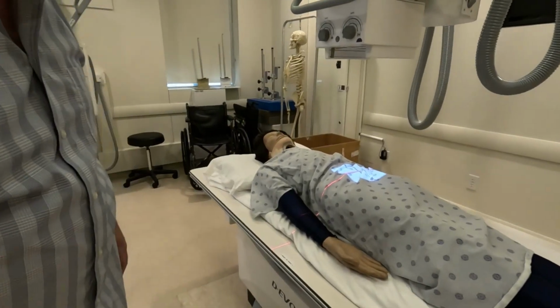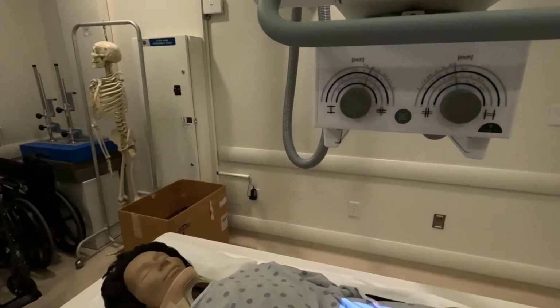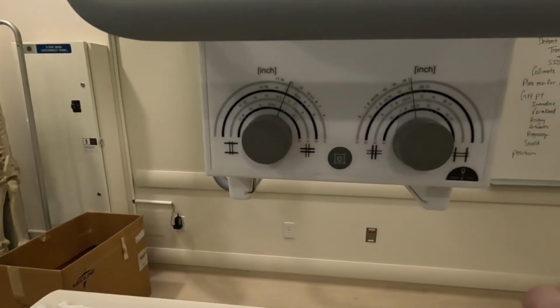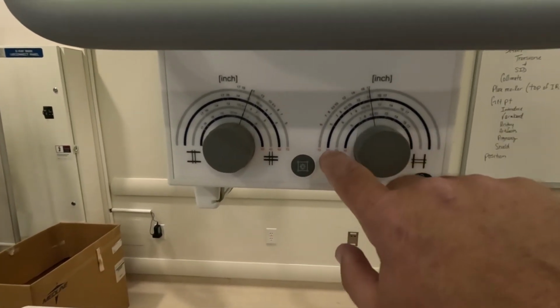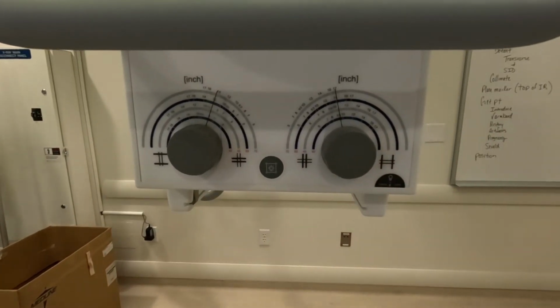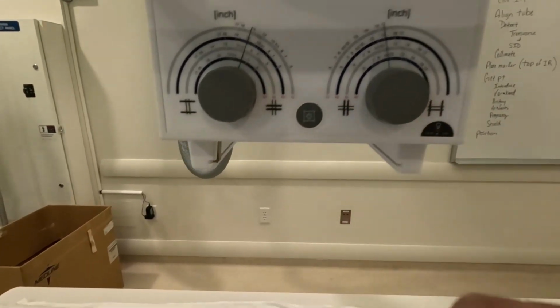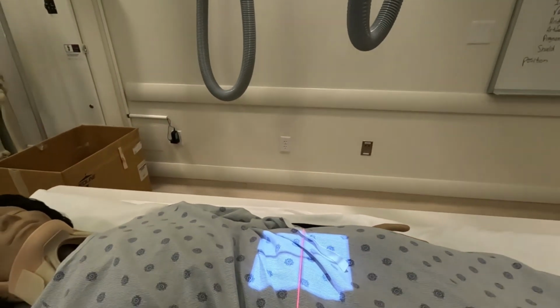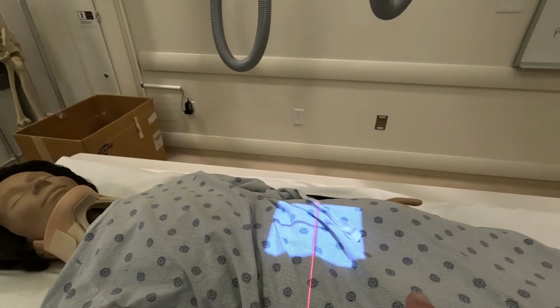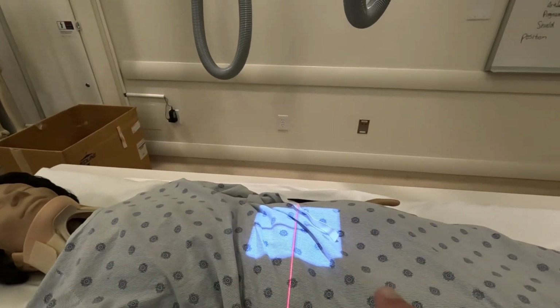The next thing would be to adjust your radiation field. So I'm going to get kind of close with this, but you can see your collimator dials, you've got 72 inches, 60 inches, 45, and 40. So let's say we're shooting the abdomen on this patient. For an abdomen, what we want is a radiation field that's 14 inches across the patient in most cases. If you have a very small patient, it can be smaller than that, and 17 inches lengthwise.